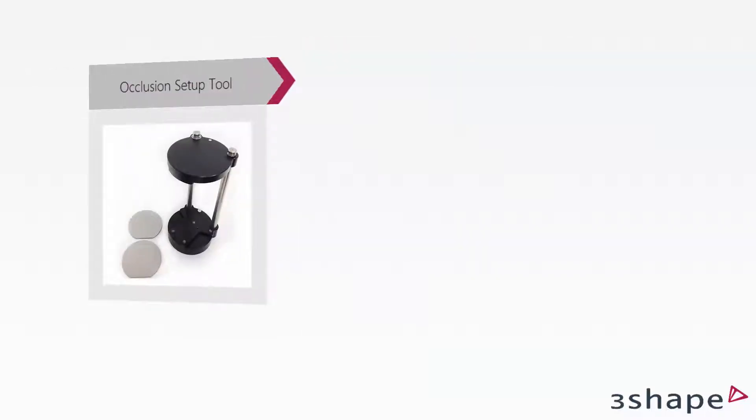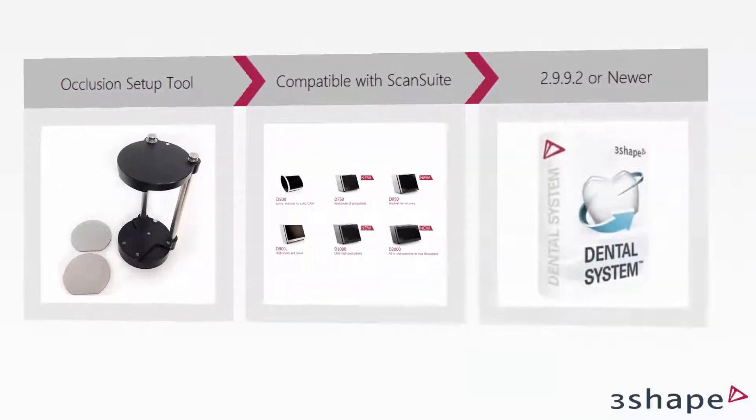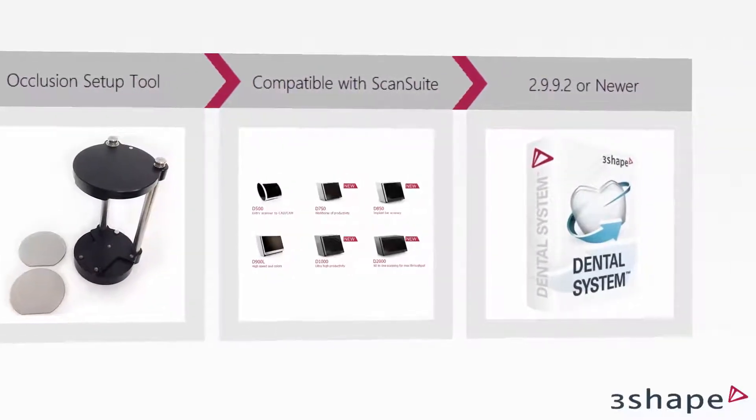The Occlusion Setup Tool can be used with all dental scanners working with ScanSuite and is supported by Dental System 2.9.9.2 or newer versions.